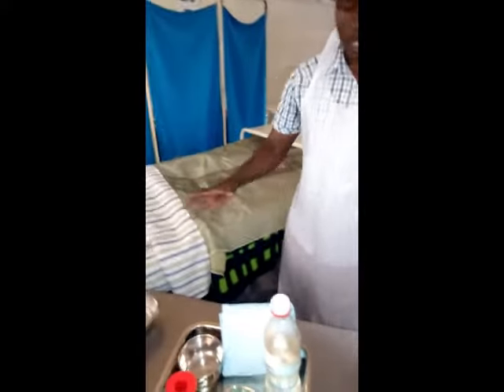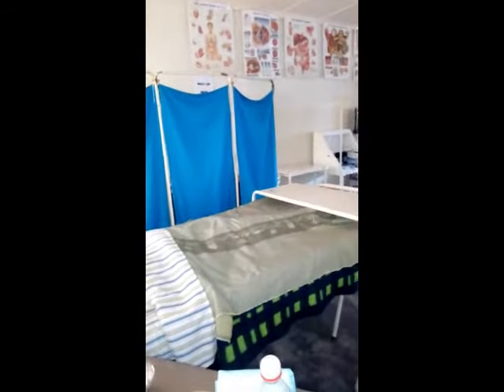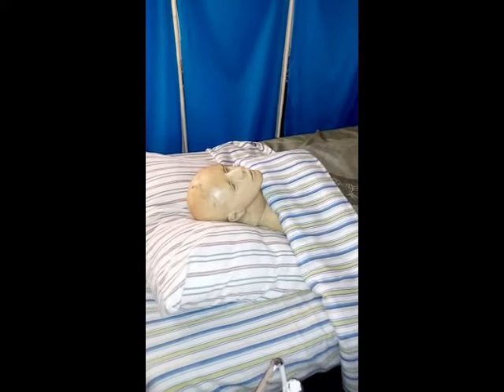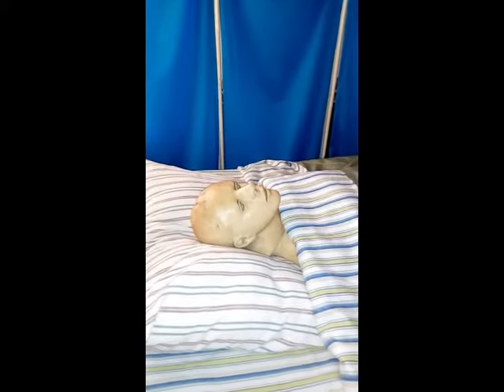Okay, so after we have introduced the trolley and all the equipment, then we have to insert. So we have to visit, this is Mrs. Mwape. Though Mrs. Mwape has got a bald head, she's Mrs. Mwape. The first thing that you do in the procedure is wash hands.